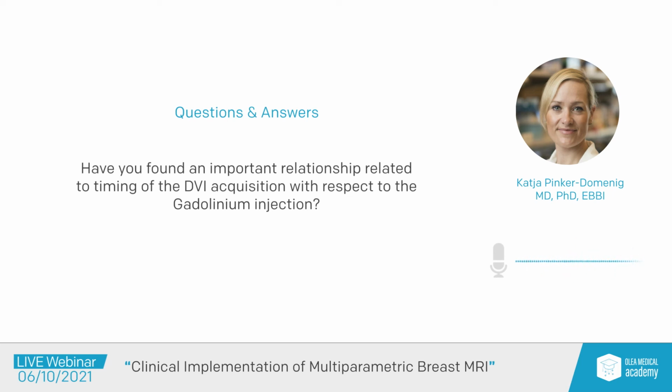In reality, it also really depends. For instance, currently we're doing it after contrast on one scanner, because we have to. We currently use MUSE, the multiplexed multi-shot DWI. For this, I have to switch the scanner. Although it is a product on the Premier system, I have to acquire it in research mode. That limits me, so I have to do it after.